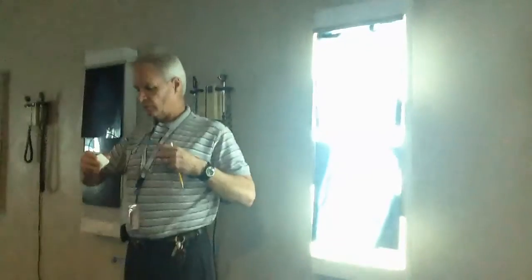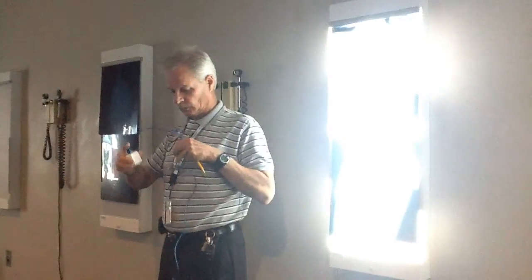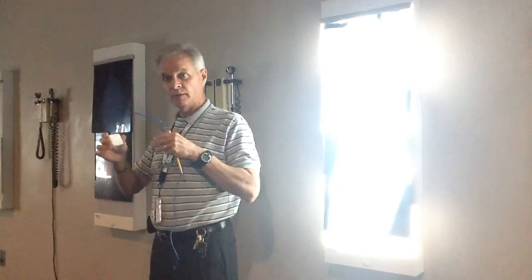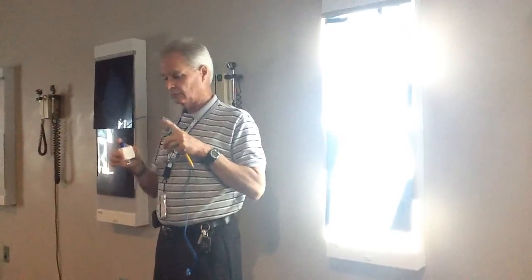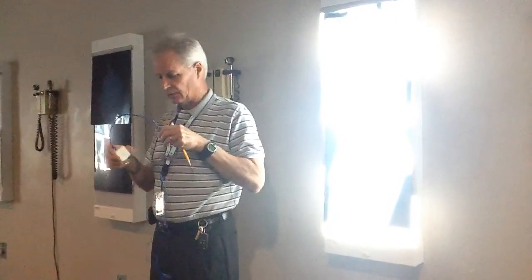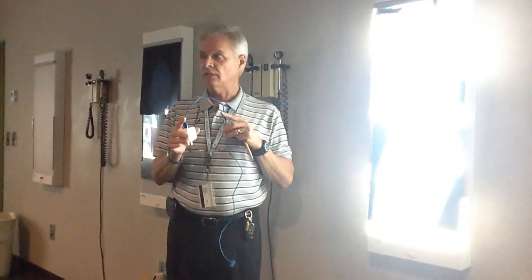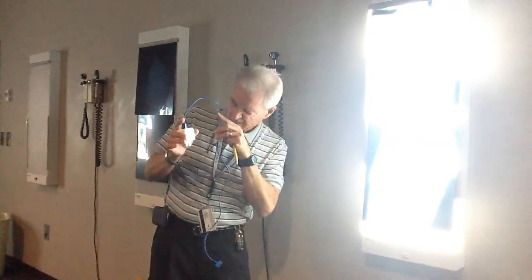Boom. There we go. We now have an aorta. Okay. Ascending, transverse, knob, descending, left hand. It's a little bit squirrely, but it'll work. There's the PA view. You see how it's an oblique aorta? Yeah, RAO, straight. Ascending, transverse, descending. And we're actually looking straight down the transverse arch. Straight through it.